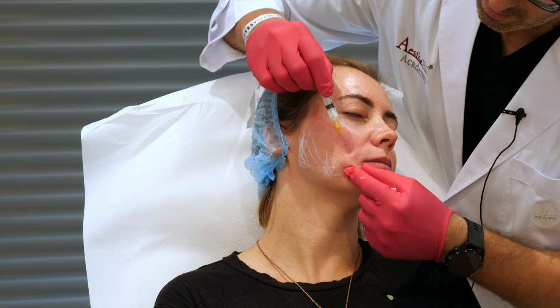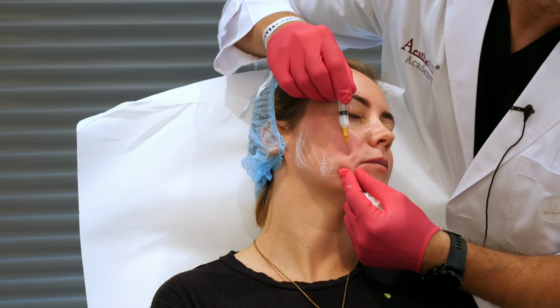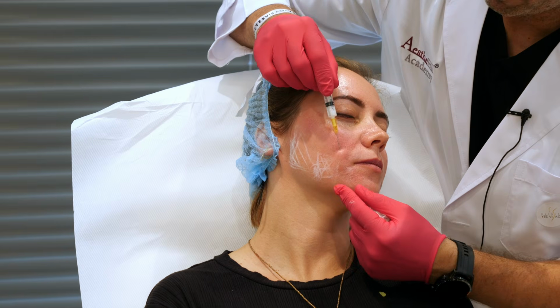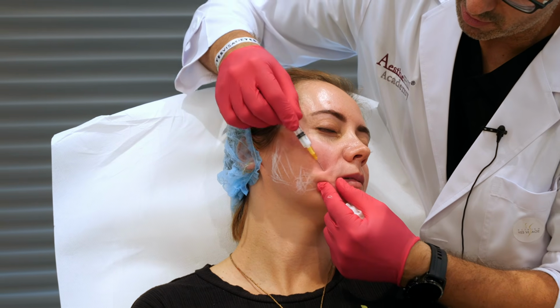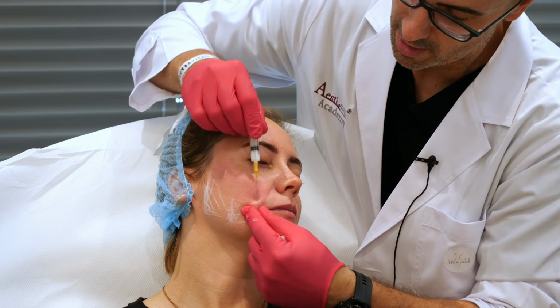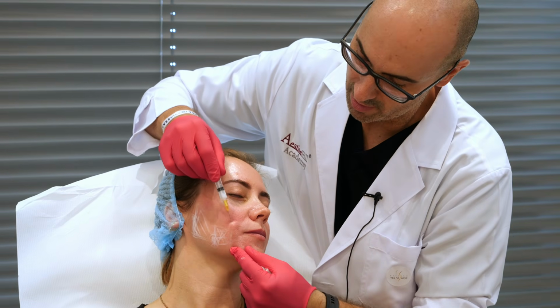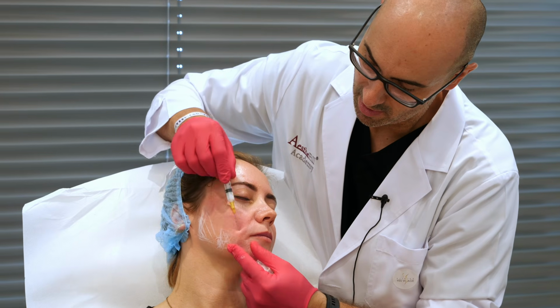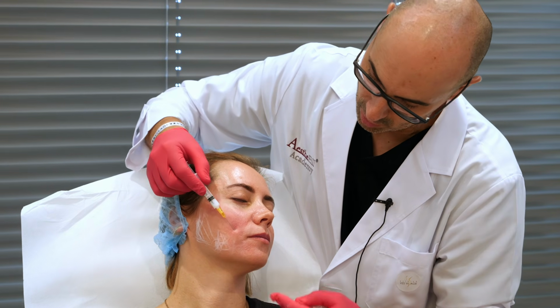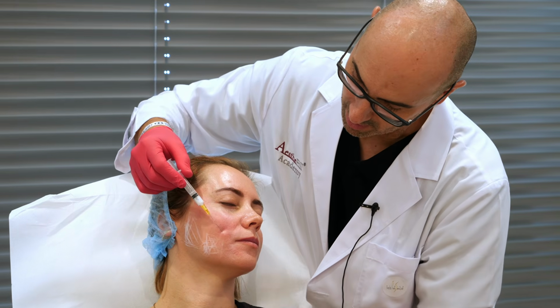You can make here a little subcision with the cannula without product, okay, to obtain better results. I don't put product just now, only pass the cannula in this zone. You can see another version of this zone just now, okay?